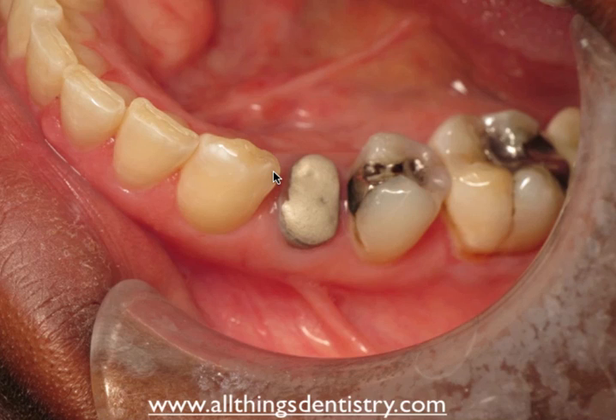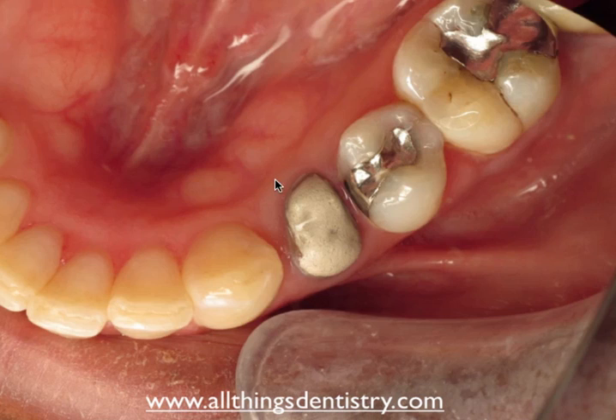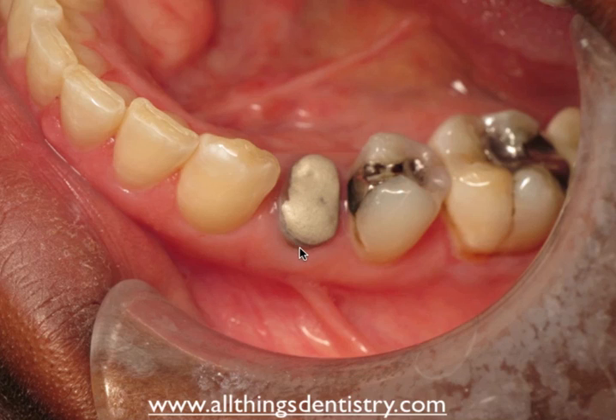One of the things to consider when crown lengthening — especially in a simple case with no restoration — is that you can get in there with an end cutting bur, hand files, whatever you like; it's very straightforward. However, one of the key things to take into consideration is the ferrule effect. When the restorative doctor restores this premolar, guidance in the literature shows you need a ferrule — approximately 1.5 to 2 millimeters of that crown contacting natural tooth.